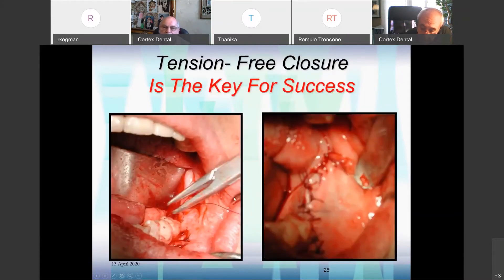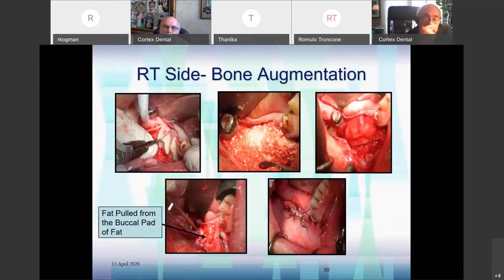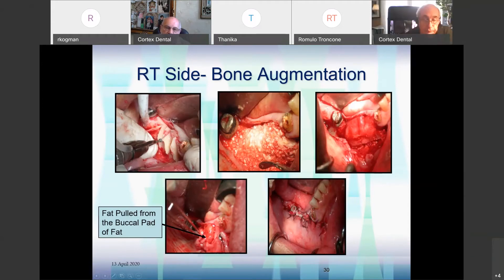Another very important matter is the tension-free closure. We must take care so the closure is complete and without any tension. You can see the parts — it was enough to use also on the right side. Again making grooves, tapping in the wedge parts, rounding them. Sometimes, if the tension is too high and we do not want to close completely, we pull fat from the buccal fat pad. It closed safely and isolated.